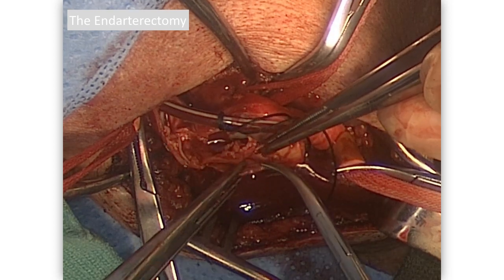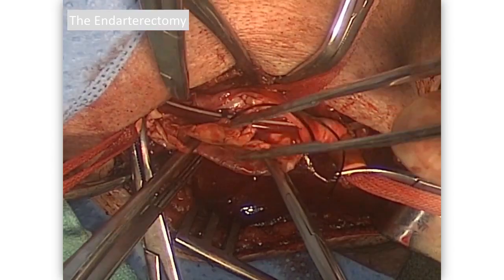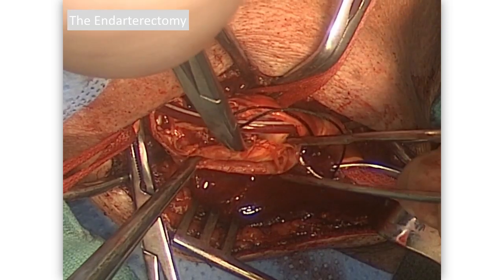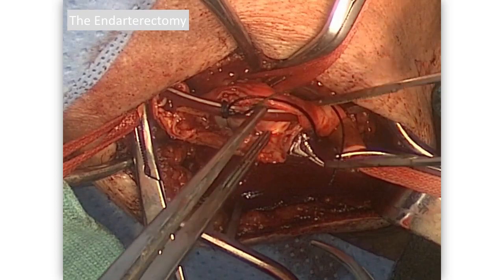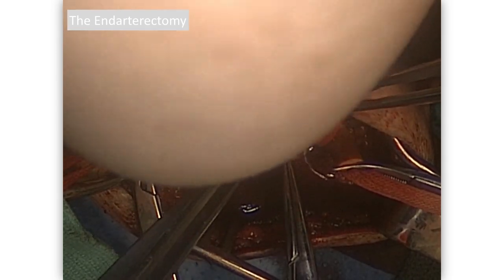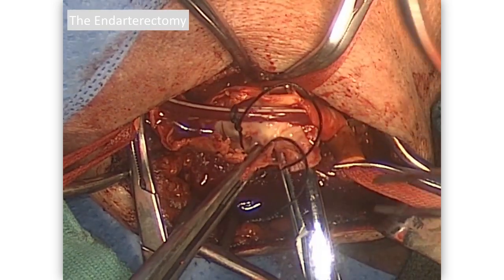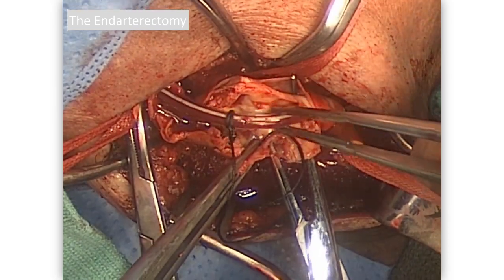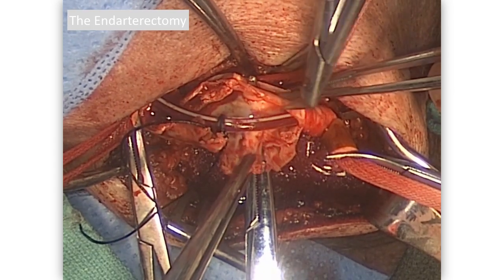Here we go. Typically I look for an area where there's a natural separation or dissection in the wall and start from there. Don't start from two different parts — start from one. These are fairly long sweeps; you can see how the plane is being developed. Usually I don't go up the internal first — I develop the proximal end first. Moving the silk ends out of the way, I come back to the end of the endarterectomy with a right angle and pop it through the other side. Then I'll spread, close, and go distal with the clamp. I take a pair of scissors and cut as near flush as possible at the proximal end of that endarterectomy plaque.